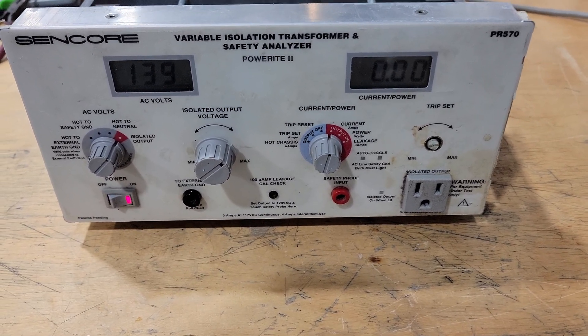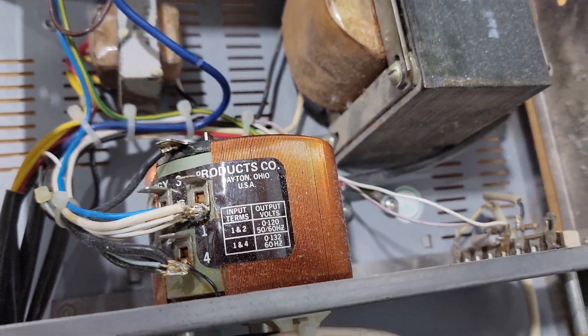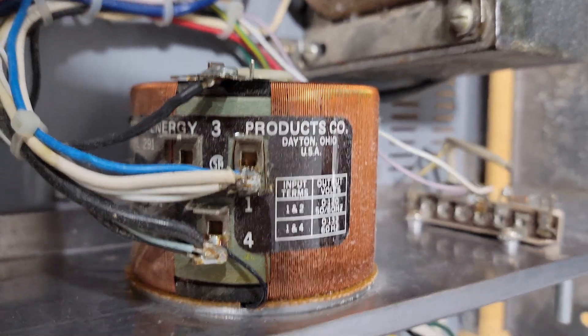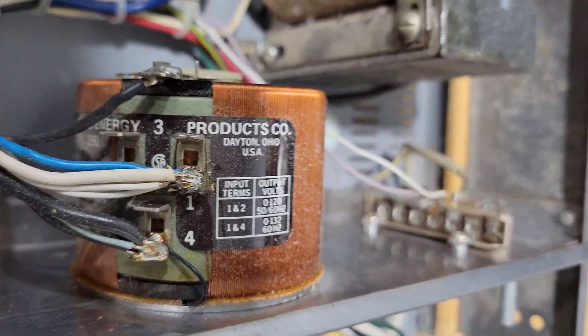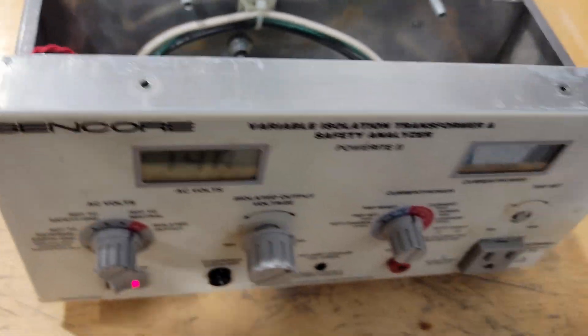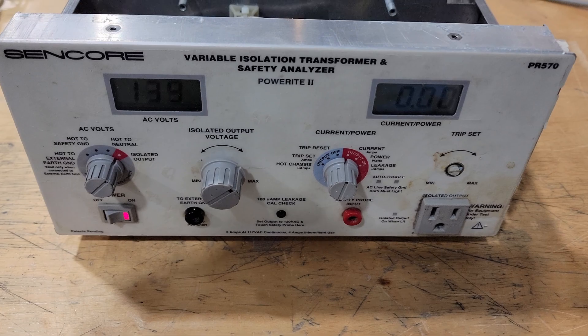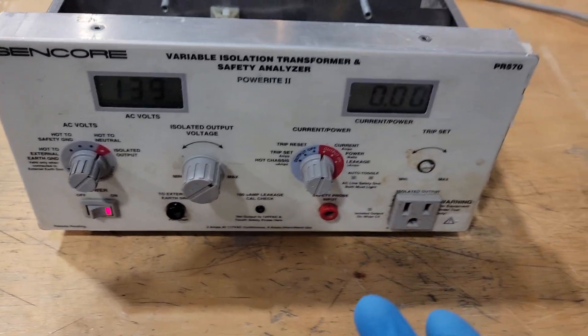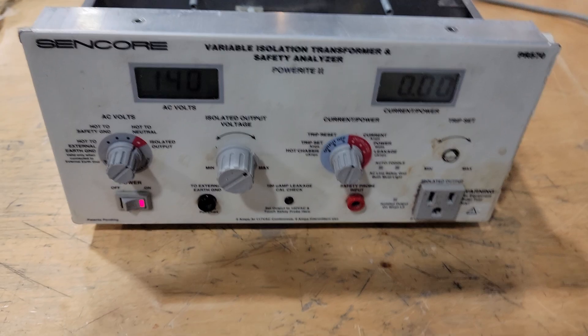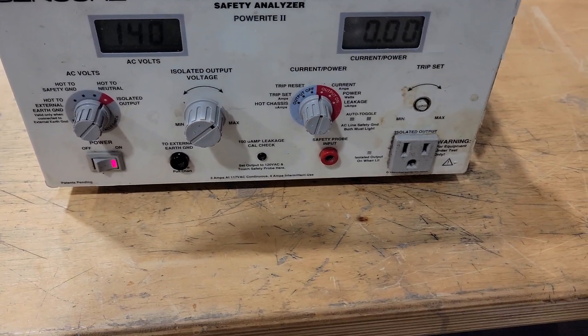I'm not totally confident. One option would be to completely replace the whole Variac, but I don't really want to do that. This one looks pretty good — it's a Staco, which is a pretty standard brand. I bet I could get a replacement if I wanted to, but I think I'll just leave this one in here because it's working fairly well. I'm going to be using this myself for other repairs, so if it's not perfect, that's okay.